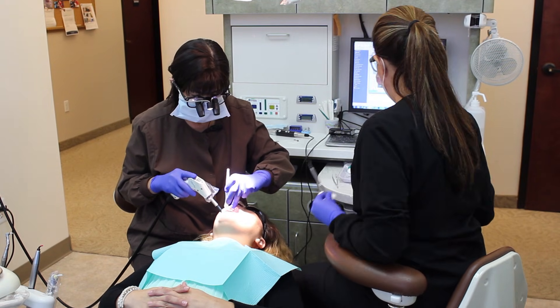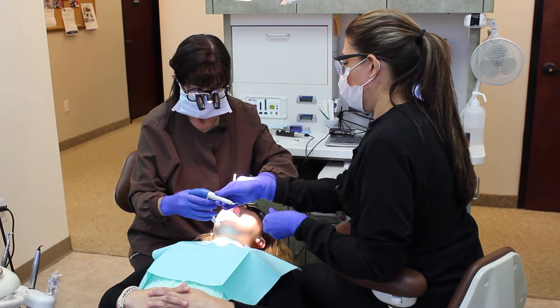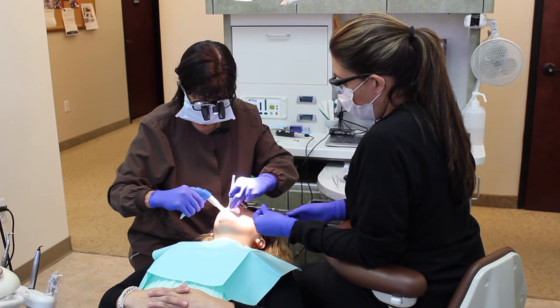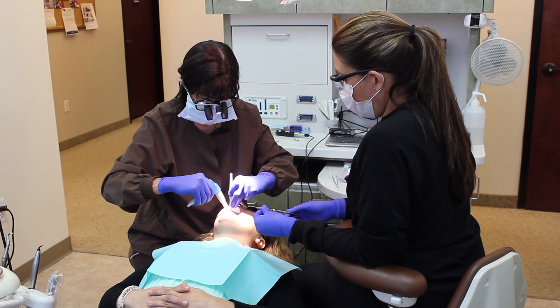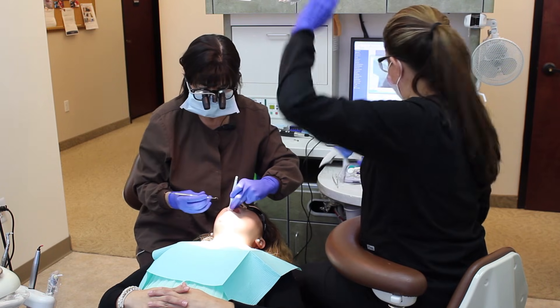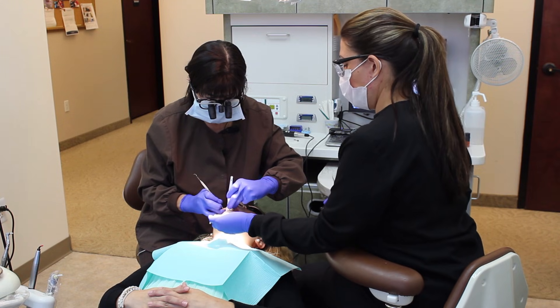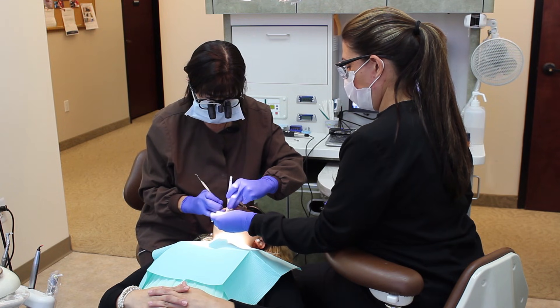I'm going to take the flowable. Because we just made tiny little holes in her tooth by removing the cavity, I can use a flowable material — it's kind of creamy and it just flows into the prep or the cavity. The other good thing about air abrasion is it leaves the surface of the tooth really super clean and creates little nooks and crannies for the filling to get a better bond. That's the other reason I like it.